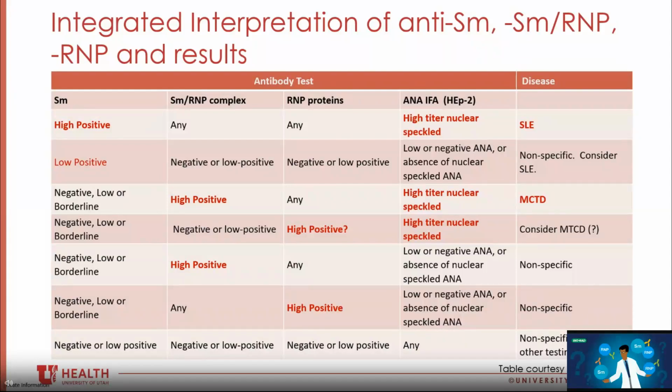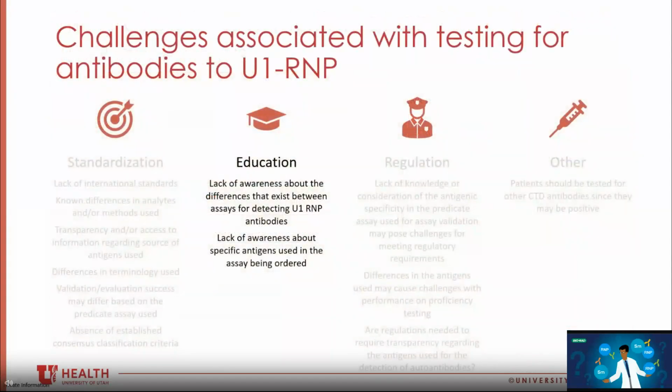With regard to education, some of the challenges associated with testing for antibodies to U1-RNP include the lack of awareness about the differences that exist between assays for detecting U1-RNP antibodies. This is a gap which I hope this presentation is helping to address, and I hope that you will assist me with addressing this by sharing this information with both your laboratory and clinical colleagues.